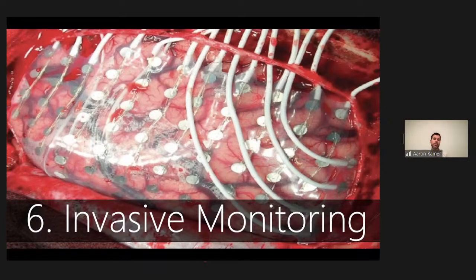Making sure that the patient is in a situation where they are most likely to have seizures, because this is an actual ictal monitoring situation. We want to see the patient having seizures and record those seizures as best we can. The reason for this being done is usually we're having a difficult time localizing where the seizures are coming from, and this invasive monitoring gets us one step closer to the part of the brain that the seizures may be coming from anatomically.